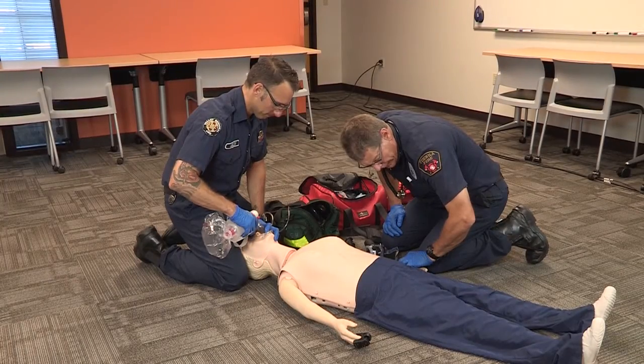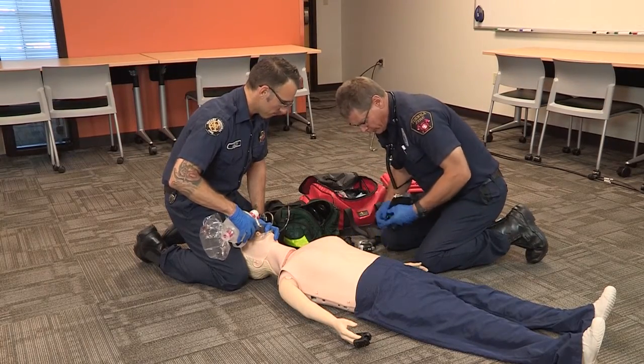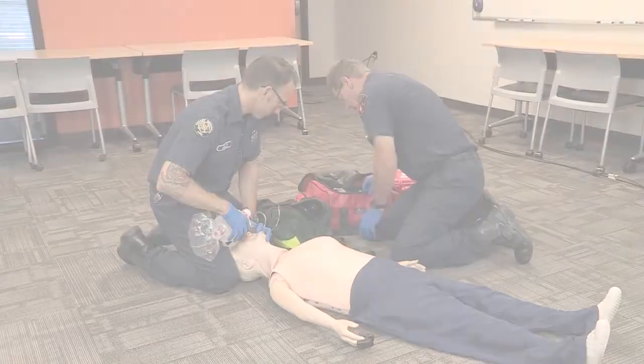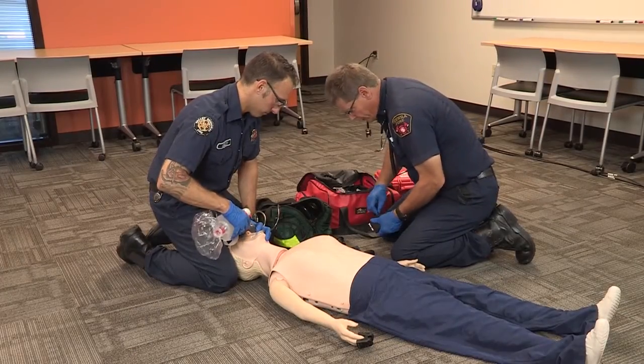We have a regular pulse of about 80. We'll take a blood pressure here. We have a blood pressure of 92 over 64. We'll go ahead and take a blood glucose on this patient.